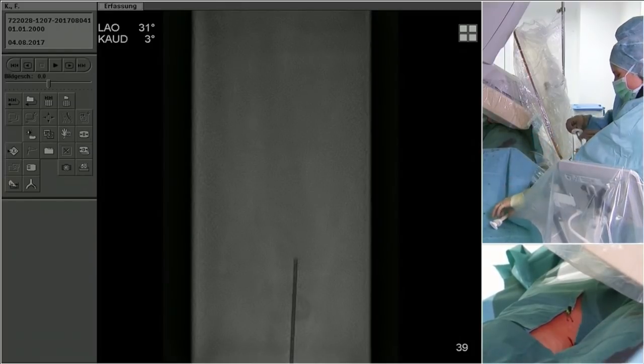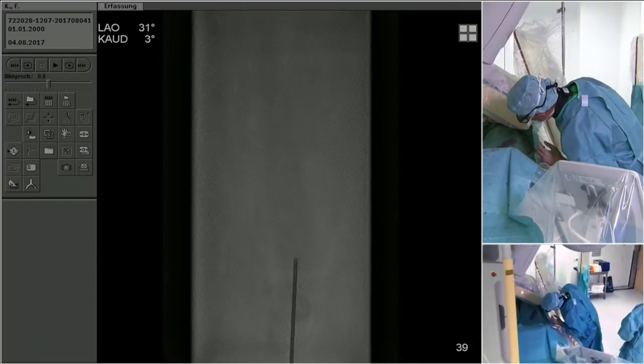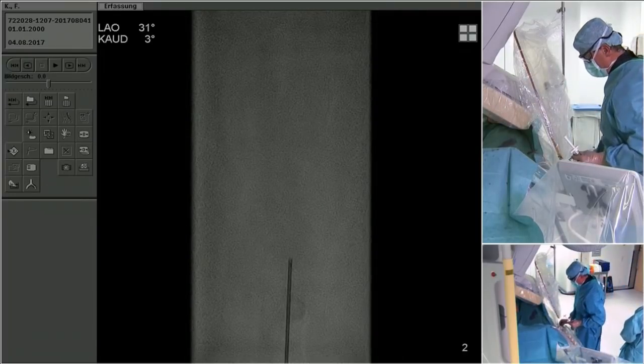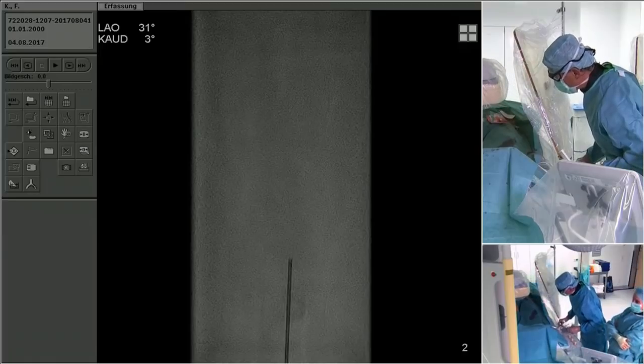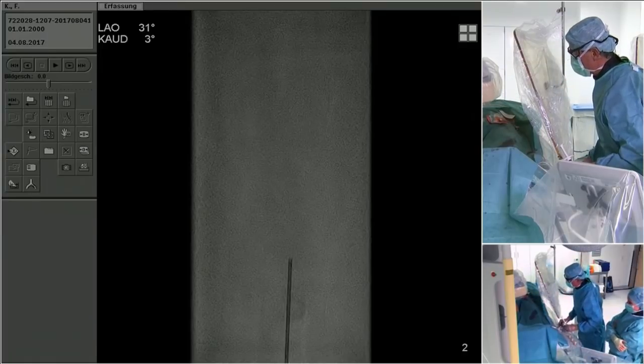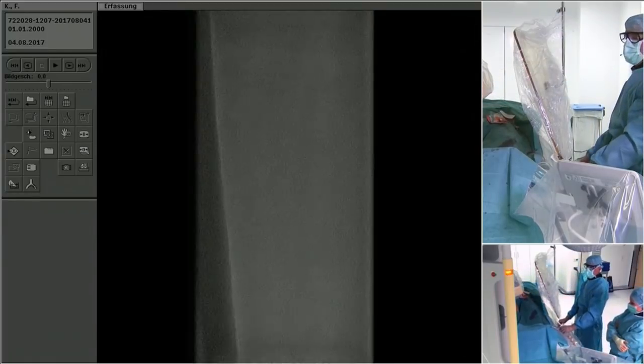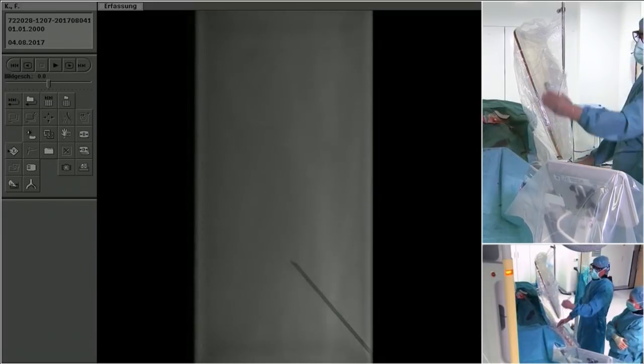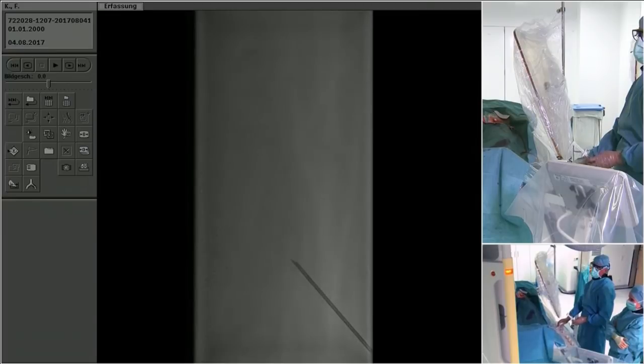Is your needle very vertical or shallow? It is, as you can see, relatively shallow. Especially for puncturing totally occluded arteries, you need a shallow approach because you need that to push into the artery. You see here, this is the angle between artery and needle.